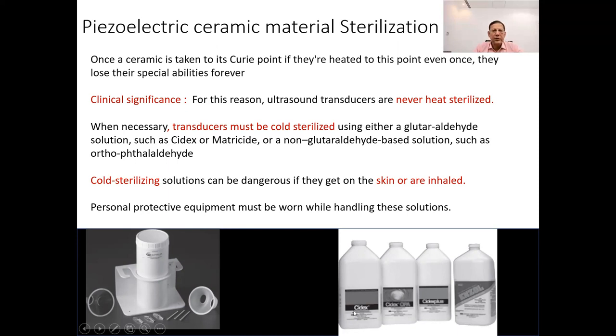This involves using special solutions, like glutaraldehyde-based ones, such as Cidex or Metricide, or non-glutaraldehyde options, like ortho-phthalaldehyde. However, these cold sterilizing solutions are not like regular household cleaners. They can be harmful if they touch the skin or are breathed in. That's why it's crucial to wear protective gear, like gloves and masks, when handling them.